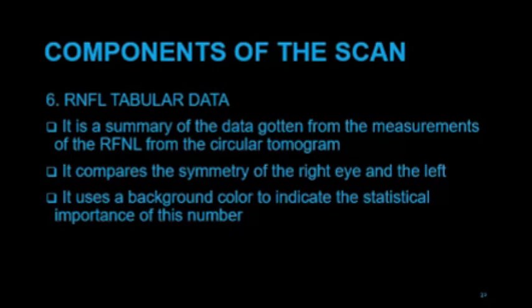The sixth component is the RNFL tabular data. It is a summary of the data gotten from the measurements of the RNFL from the circular tomogram. Don't worry, don't bother about all these terminologies. I just want you to get the basics. The more you practice, the more you bring up cases, the more all these things I'm saying will begin to align and make sense to you.